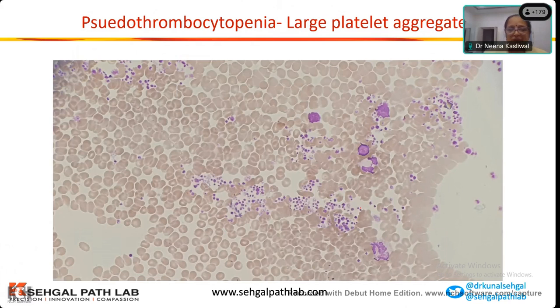I just want to add, Dr. Kunal, yes ma'am, the way you rightly said, with histograms they can analyze anything. Even early deficiencies of iron, a slight shift to the left, or early macrocytosis, if they are vigilant. The MCV and many parameters are normal, but one or two parameters like MCH or RBC count may be abnormal, and if they concentrate and develop curiosity, they can analyze.